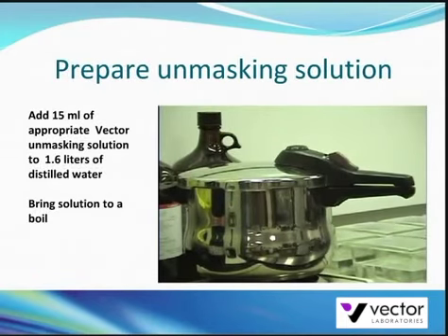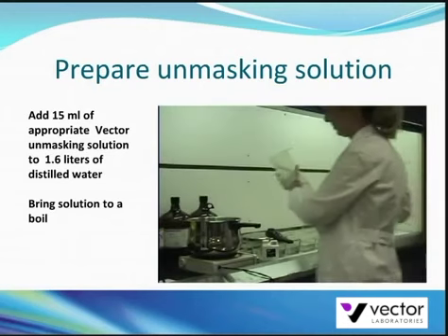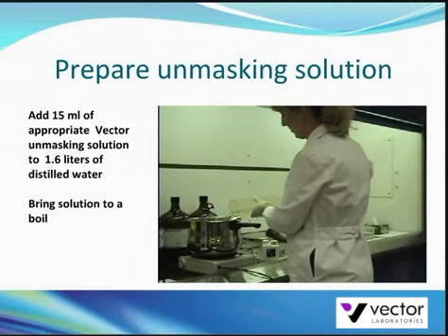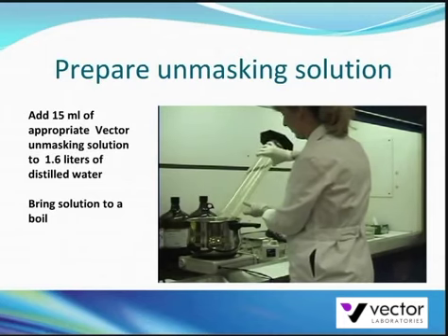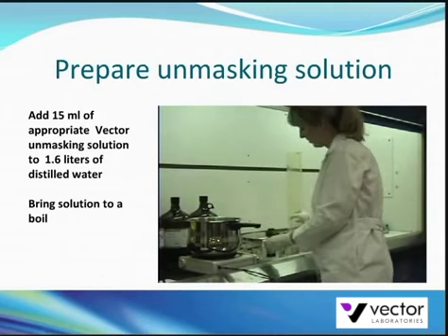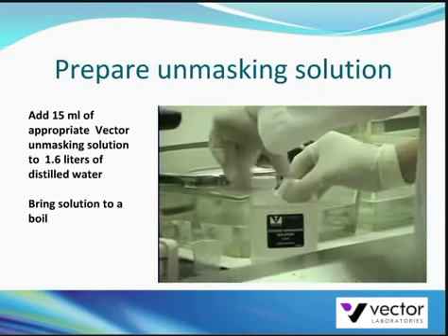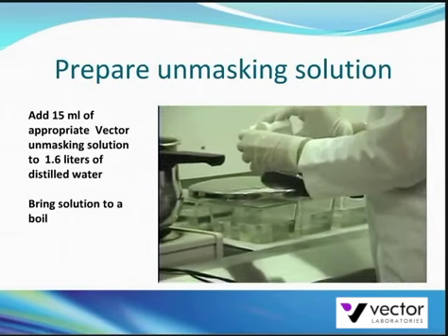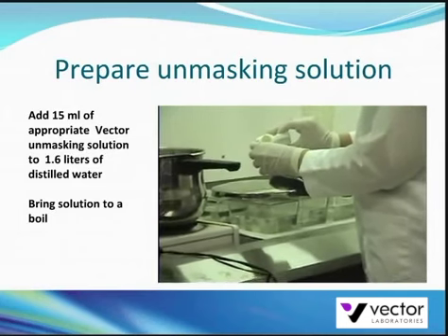For the pressure cooker technique, we use a 6 quart pressure cooker available at any department store on top of a single table top range. Pour 1.6 liters of distilled water into the pressure cooker, then add 15 mils of the appropriate antigen unmasking solution.